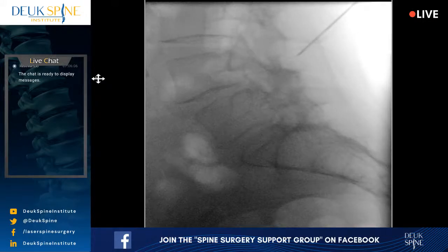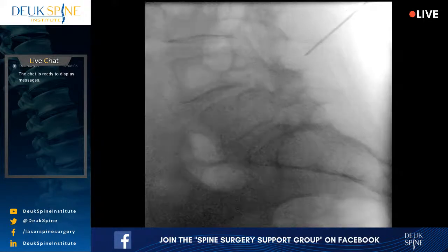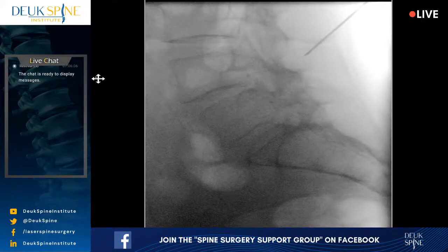Just think about holding a laser at night in your hand and pointing it at a star, okay? That's what we have to do. We have a starting point, which is my hand where I'm holding the laser beam, so the origin, and then we have a destination, which is the star.